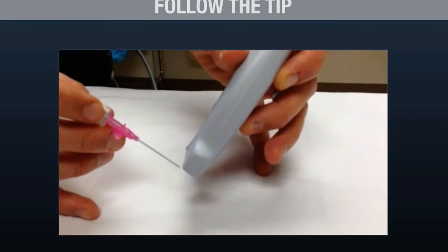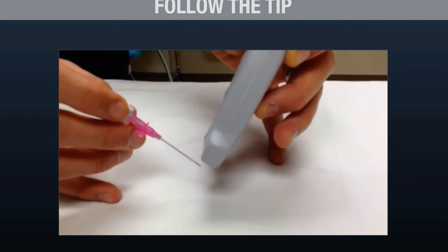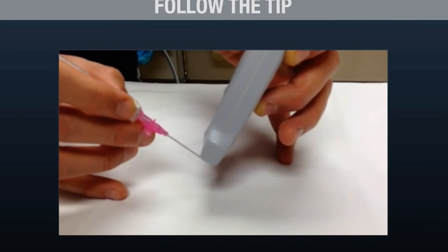As you can see here, as we're placing our IV, going in deeper, when we get to the probe, it's so easy to go past the beam. Whereas what you need to do is follow the tip with the probe the whole time. By doing this, you prevent the posterior puncture and you see the tip.